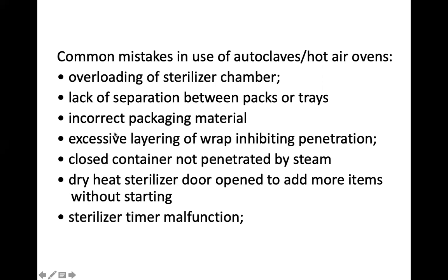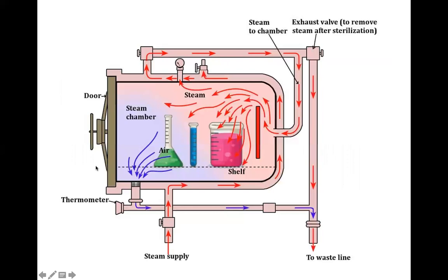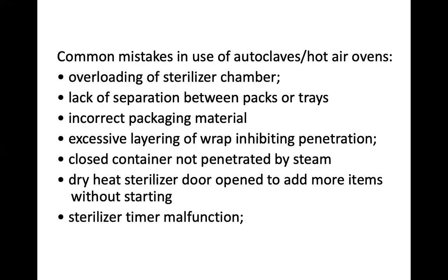Opening this door to add in other items before the process is complete, that is wrong. Anytime you start a sterilization process with these heating machines, let that process end. Then you start a new process to sterilize a new item.